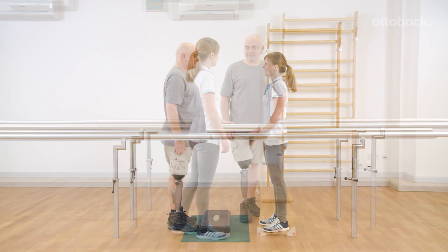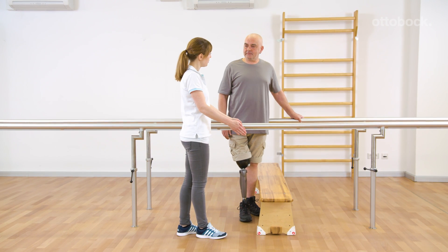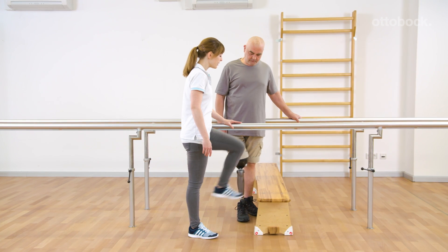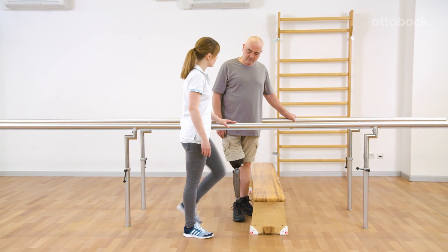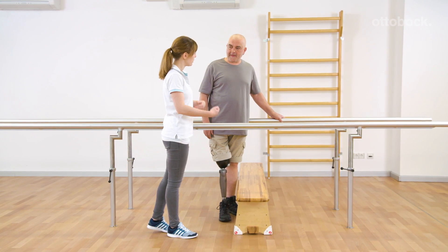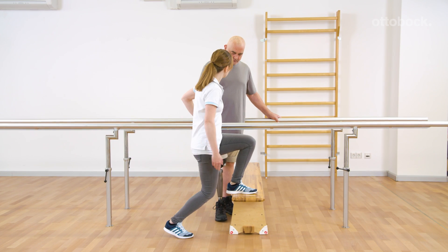The following exercise is used for extending the length of stance phase while walking on level ground. The hip extensors are activated more intensively and the center of mass moves forward more dynamically. The prosthetic knee joint identifies this exercise as a step and allows stance release.